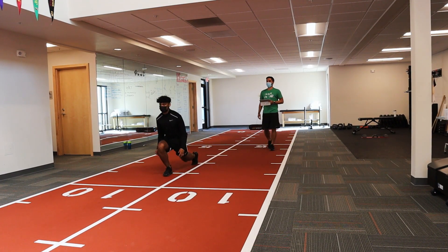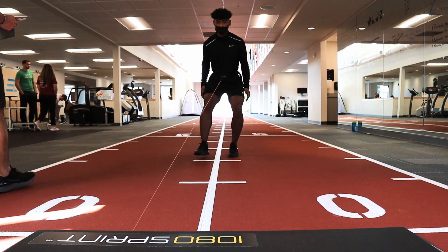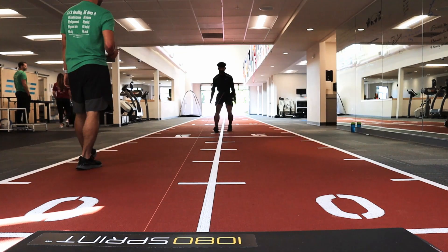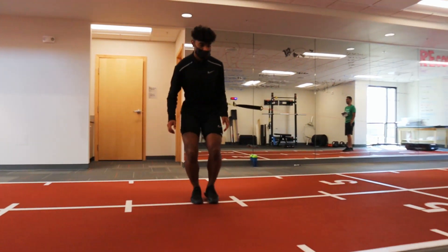Especially if they're here for months at a time from a bigger surgery, it helps to be able to quantify and show them that there are new goals that we can achieve. Even though we've been doing similar things for a while, there's still room for improvement. There's still new heights that they can hit, and the 1080 allows us to give them that information and show them what's possible.